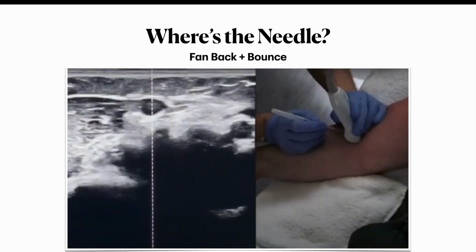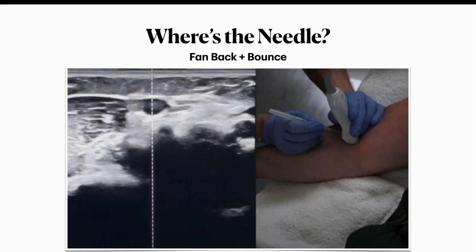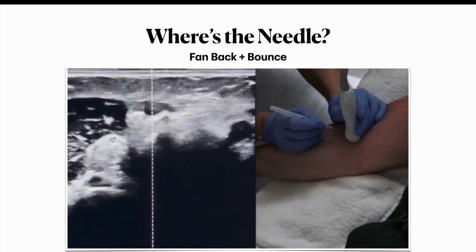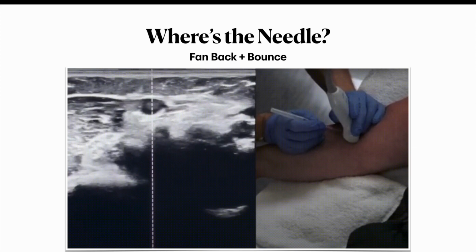I do not want you to stress about learning these techniques, and in fact, as you go, you will find that combining them will be natural and help you find the needle tip. So if we combine the fanning and the bouncing all in one example, we'll see that the needle tip does indeed show up on the screen. Slightly advance, fan back the probe, bounce the needle, there it is.